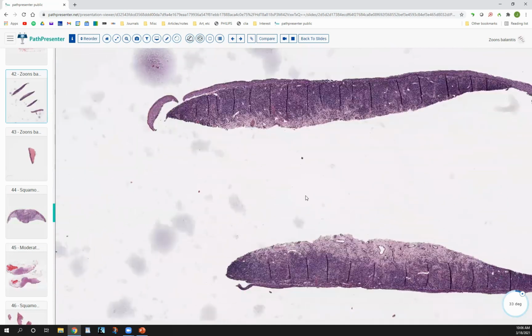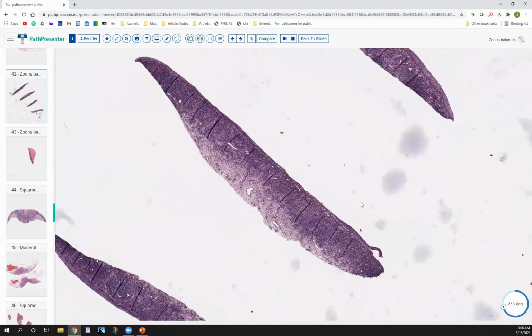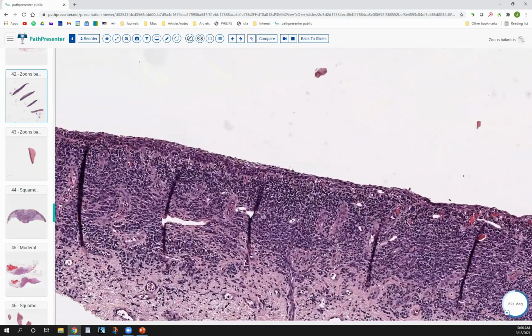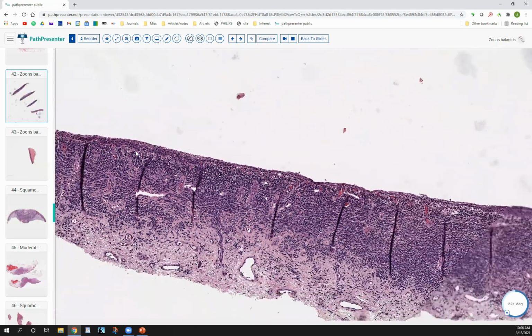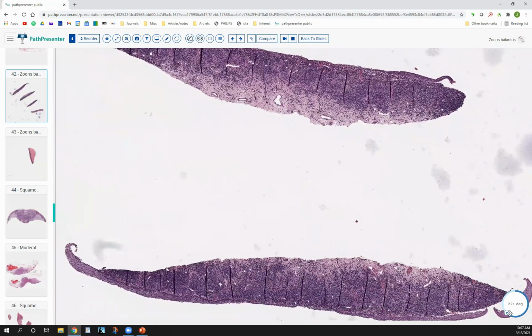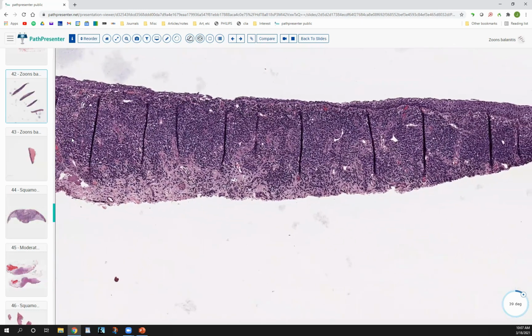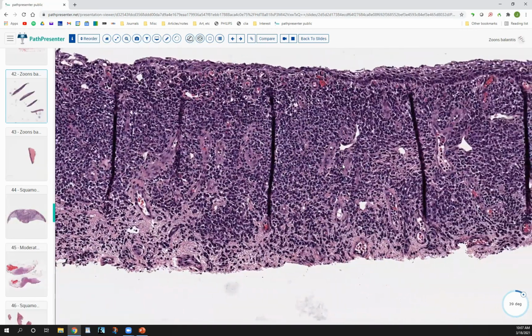In some areas, you may have a little bit of a flatter epidermis, like what we were talking about. And you may have an appearance of some of these sort of diamond-shaped or lozenge-shaped cells. That's a quality I've always had difficulty appreciating. But I think if you look at a few of these over time, it becomes a little bit easier. The thing that's not difficult to appreciate is this very brisk band-like lymphocytic infiltrate, which has a lot of plasma cells. So by now you probably got the diagnosis.